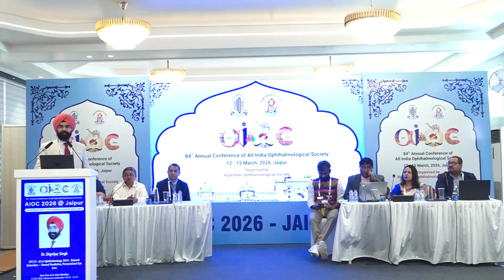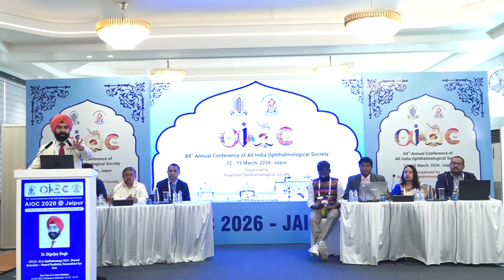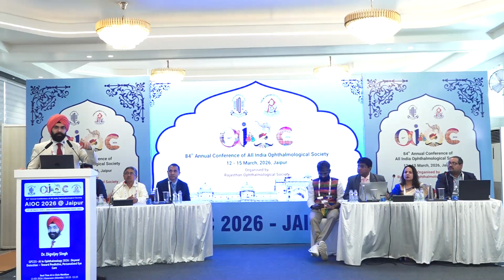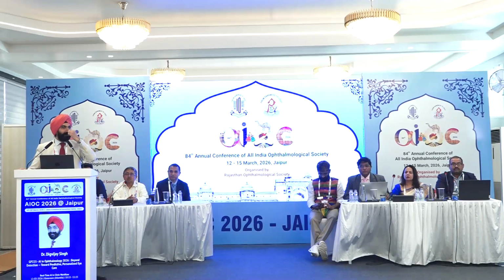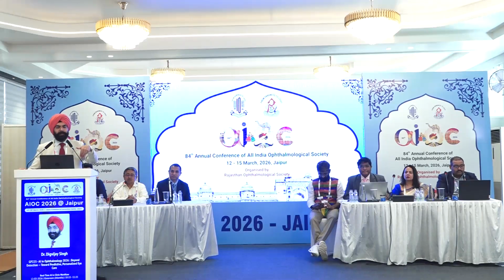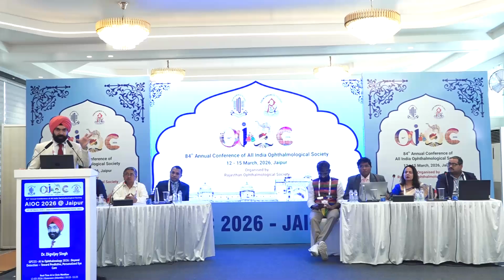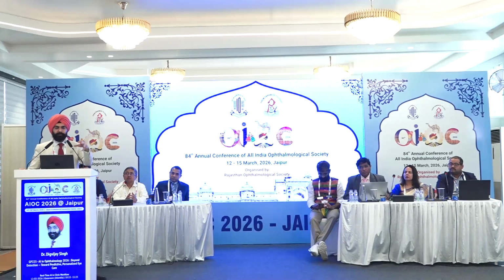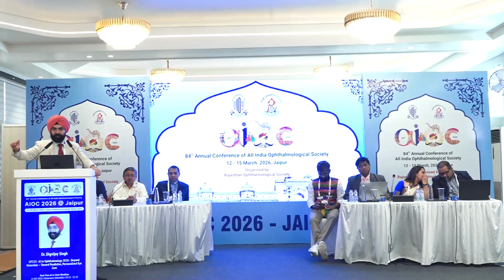Prompts are very important. For example, in that OCT where I was showing first both eyes, then one right eye, I wanted it to tell me whether the right eye has progressed beyond, compared to the left eye, or progressed differently. It will tell you that specifically. If you're looking at a particular quadrant, you can ask for that also. In most of these cases, I've asked for a summary of these reports along with a specific question: tell me what has been the progression in the right eye. That was the eye we were worried about.